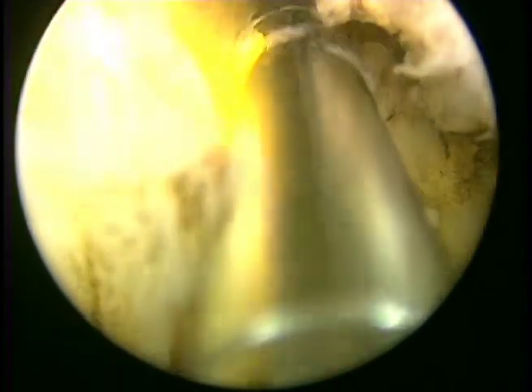In this particular case, due to the asymmetry of that left lateral lobe, we have carved in almost at a 3 o'clock position to dive down toward capsule. We then come back to the natural neutral position and begin the treatment down to capsule at the 7 o'clock groove. We will pass repetitively from bladder neck to verum montanum, always pulling back toward the scope and toward the verum montanum rather than anteriorly, particularly because if we slip, we enter the bladder, we may injure that orifice.